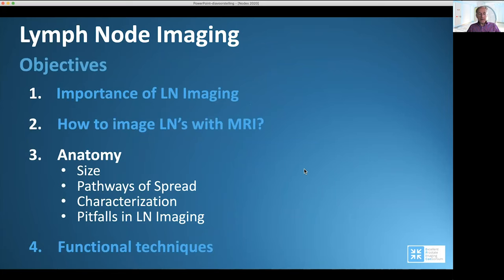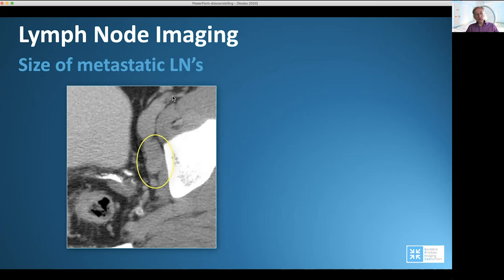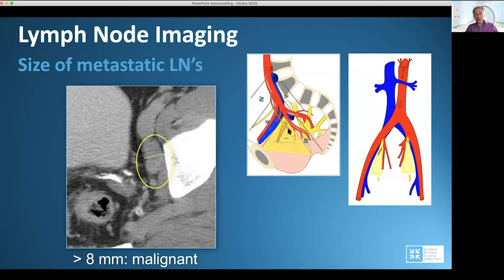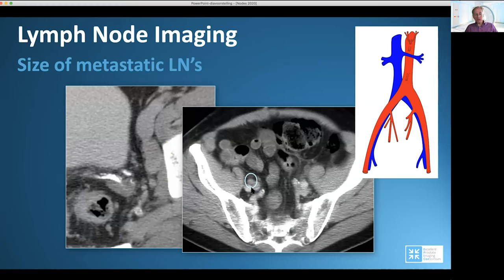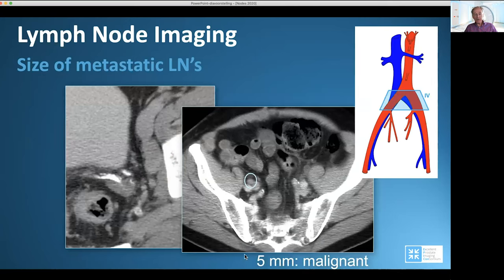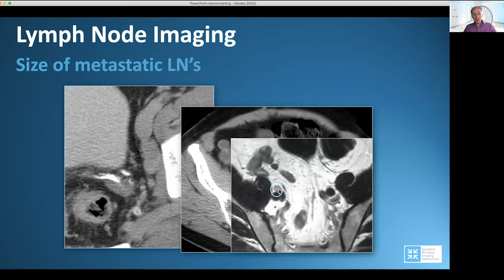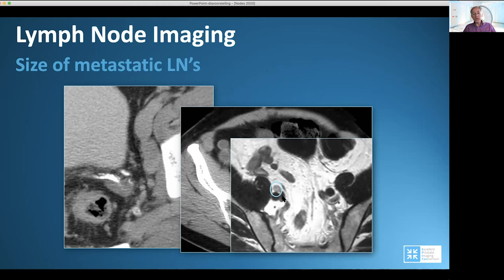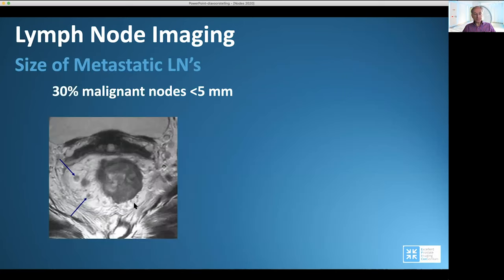Regarding anatomy and lymph node size: a large lymph node identified in the obturator fossa — identified by the external iliac and internal iliac vessels — and another located anterior to the common iliac vessels, which is in the common iliac region. This second node has a size of five millimeters, which by size and shape criteria — being a round lymph node smaller than eight millimeters — is not considered pathologic. However, it turned out to be malignant. A six-millimeter lymph node in the common iliac region also appeared to be malignant. So small lymph nodes can be pathologic.